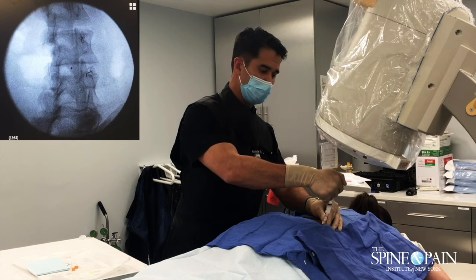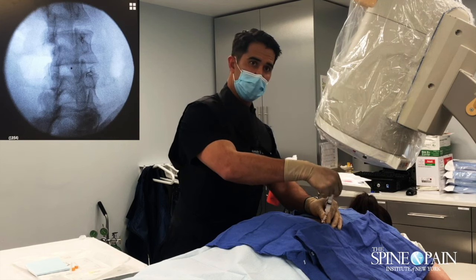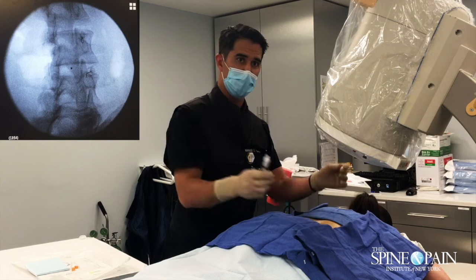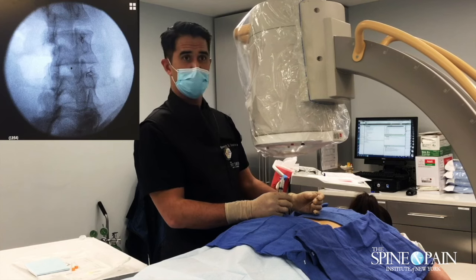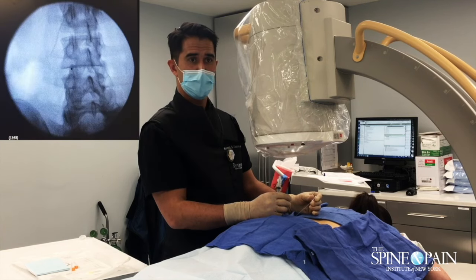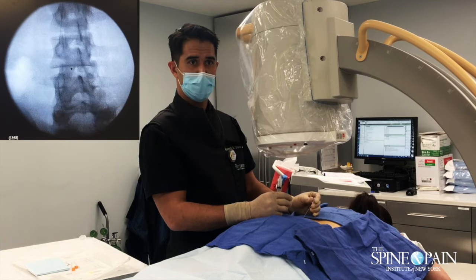You can clearly see the facet joints at those levels. That nerve comes down, wraps around right there, and splits and goes to the joint below. So technically, to get one joint, you have to block the nerve above and below.